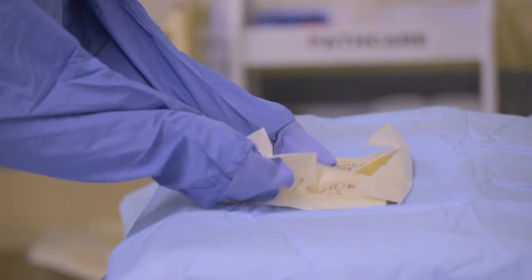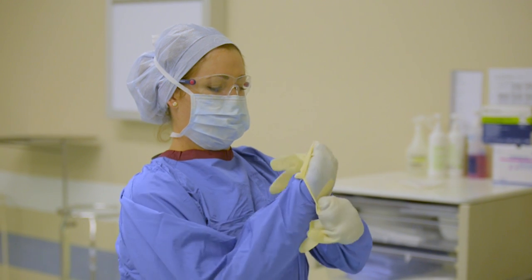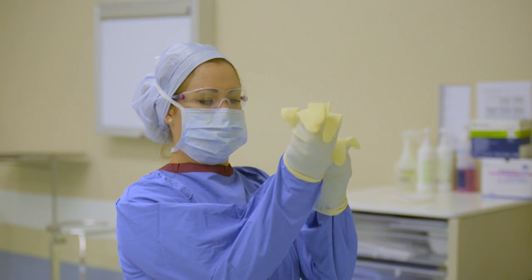After you put on your sterile gown you will put on sterile gloves. Sterile gloves are there to protect you as the wearer from the patient's body fluids, and also because we are going to work with sterile instruments.